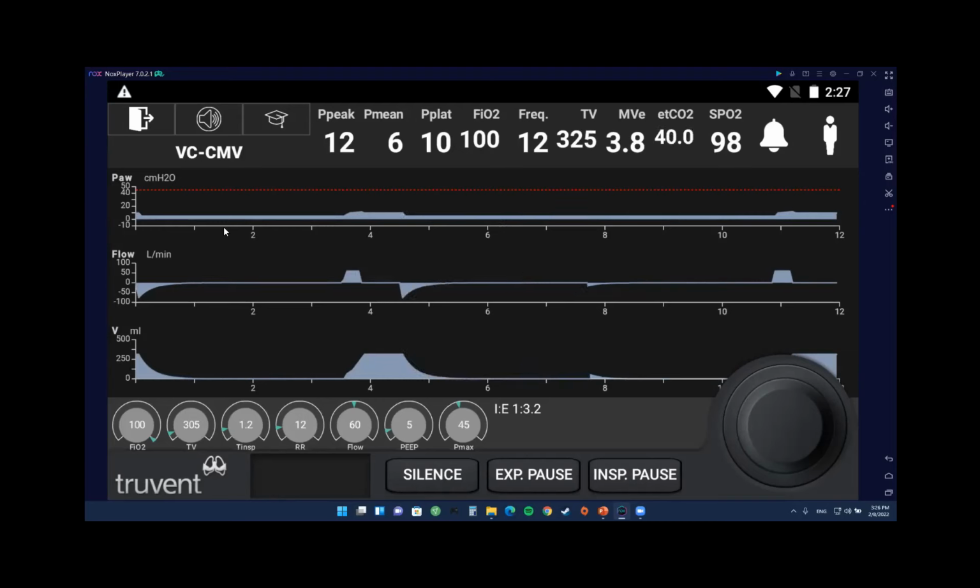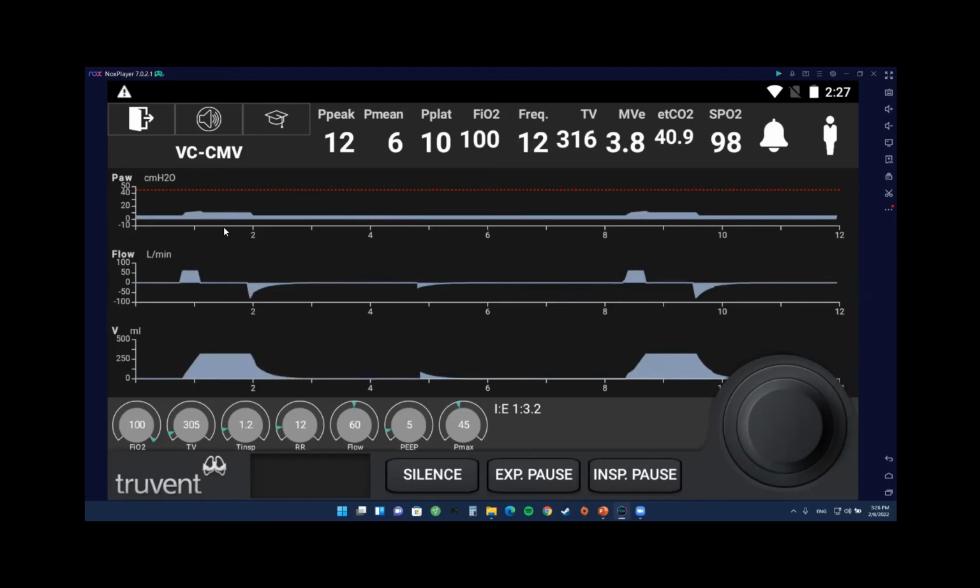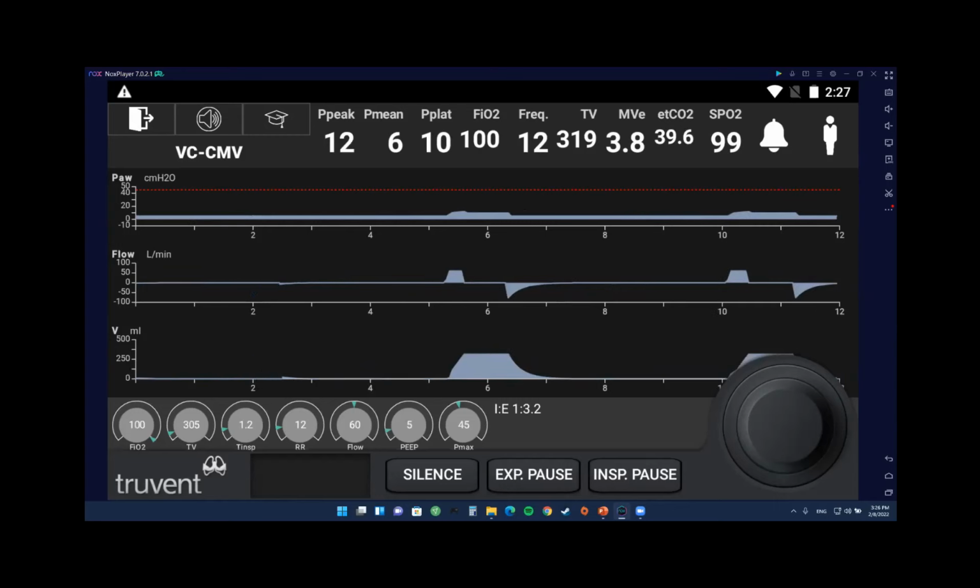Well, in a patient who has a low pH and a metabolic acidosis, normally the body would try to compensate by increasing ventilation to blow off CO2. So essentially, we want to try to mimic that with the ventilator. There would be two ways to do that: either increasing the tidal volume or increasing the respiratory rate. We don't know the person's ideal body weight, so without knowing that, I don't know if they're closer to the 6 or the 8 cc's.